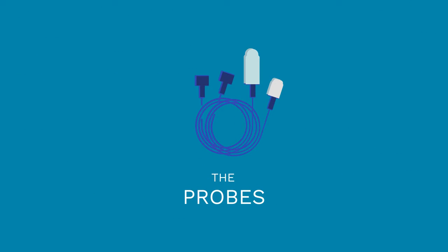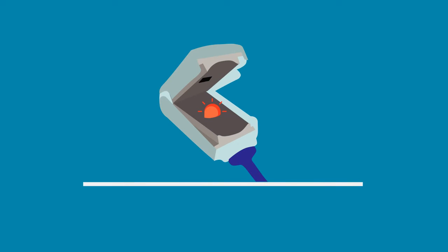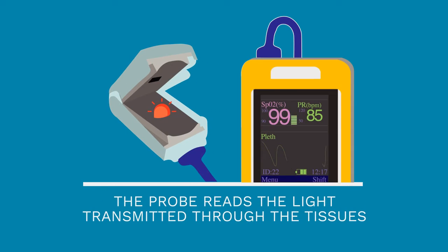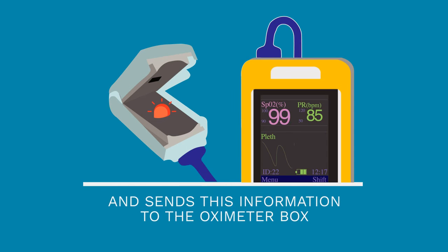Now let's talk about the probes. When the oximeter is on, you'll see a small red light on one side of the oximeter pad, the LED, and the photodetector on the other side. The probe reads the light transmitted through the tissues and sends this information to the oximeter box.